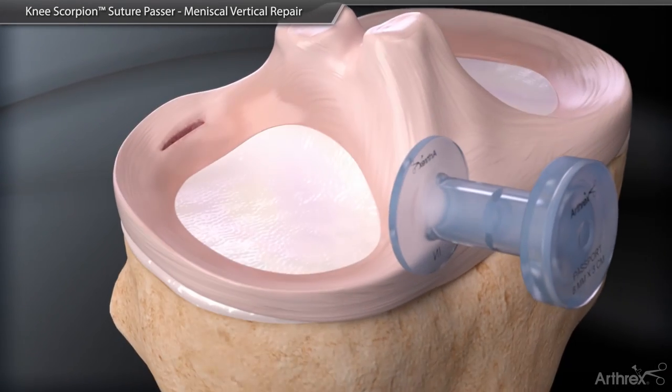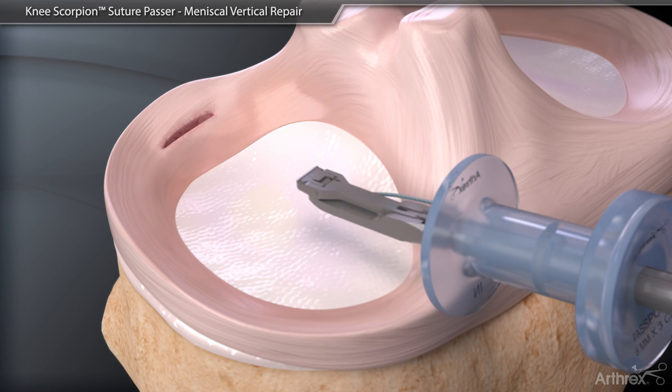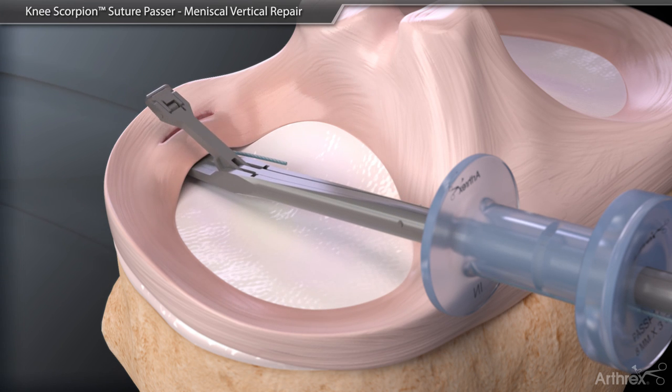Introduce the Knee Scorpion with the suture loaded into the joint space through a passport button cannula. Once in the posterior aspect of the knee, open the jaws of the Knee Scorpion and grasp the meniscus.